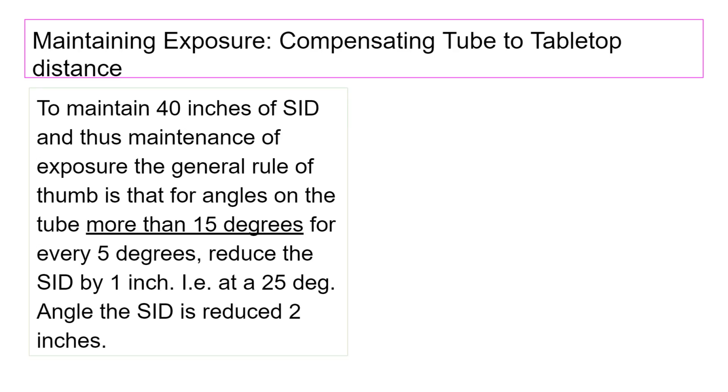So let's say your tube is perpendicular at 40 inches SID, but you're going to angle it at 25 degrees.